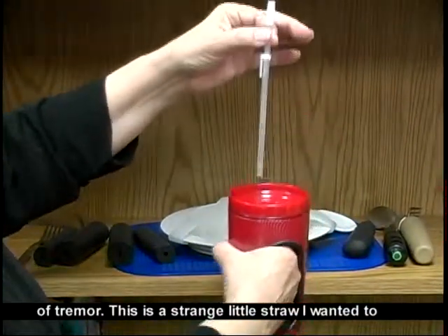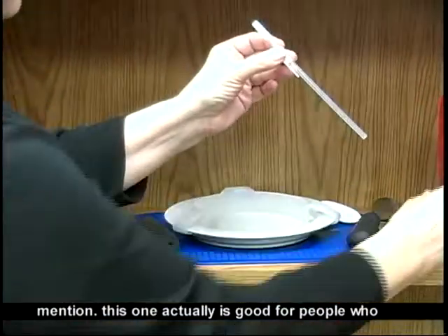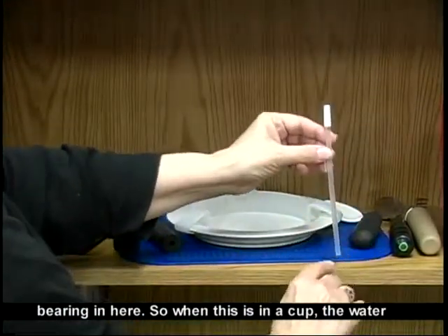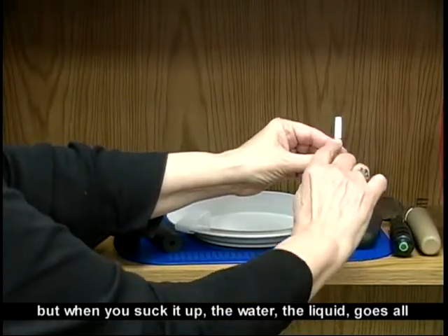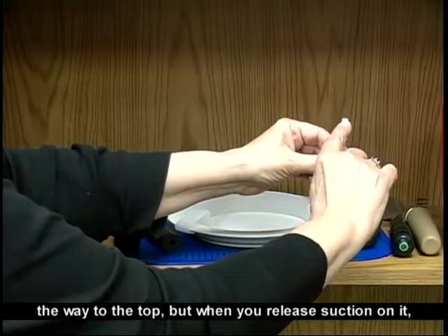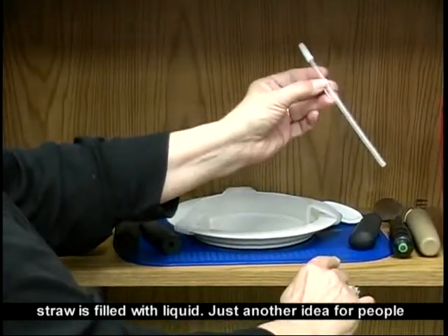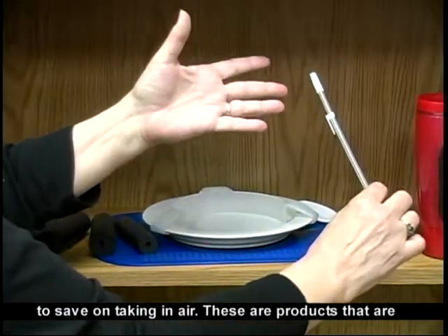This is a strange little straw I wanted to mention. This one actually is good for people who shouldn't be swallowing air. There's actually a ball bearing in here. So when this is in a cup, the water level would be normal at whatever you're drinking at, but when you suck it up, the liquid goes all the way to the top, but when you release suction on it, the ball only travels to about there, and so this whole straw is filled with liquid. Just another idea for people to save on taking in air.